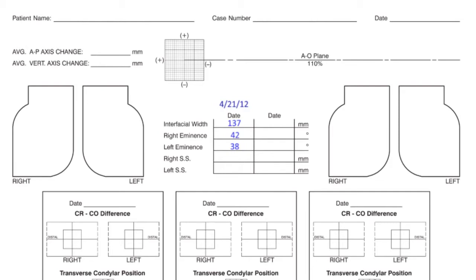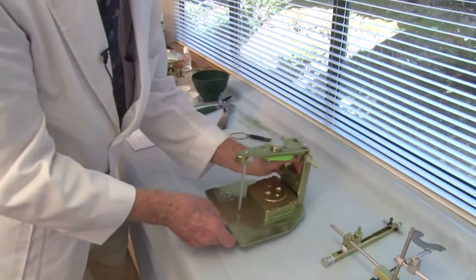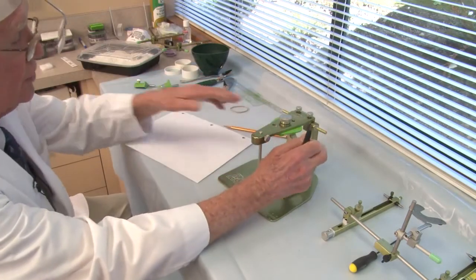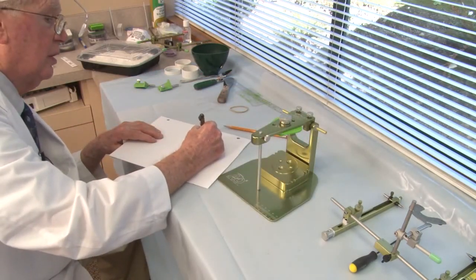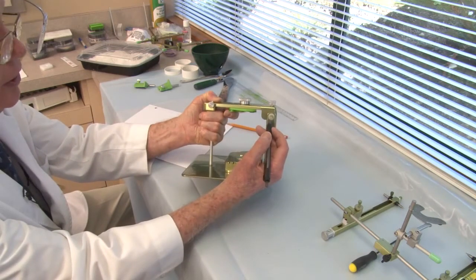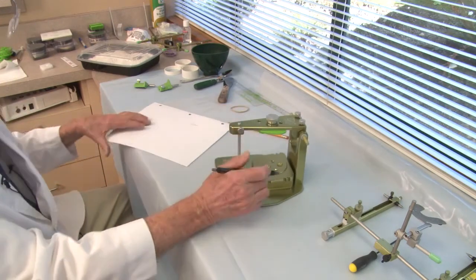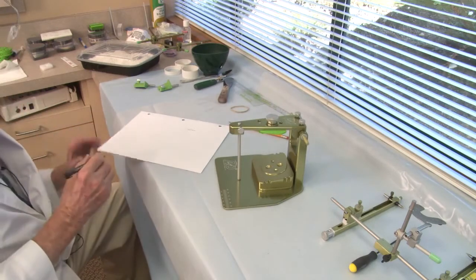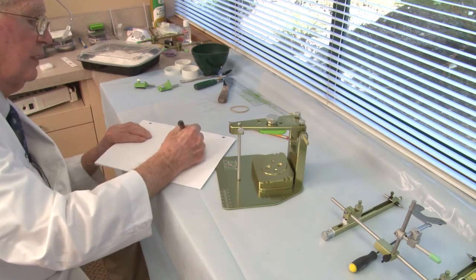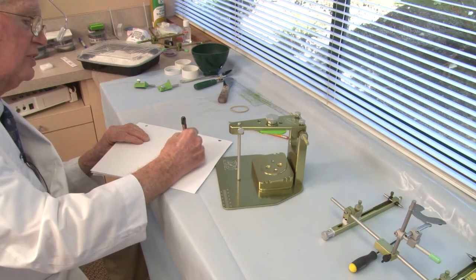And we have to now mount our upper model on the hinge axis mounting stand. The hinge axis mounting stand, I've already put a mounting plate on. When this is set on 0, it's 120 millimeters. That's from the depth of the hole here, which is 1 millimeter, to the depth of the hole on the other side, which is 1 millimeter. So that distance is 120 millimeters. The patient's interface width was 137 millimeters. So if I subtract 120 from 137, I get 17 millimeters.